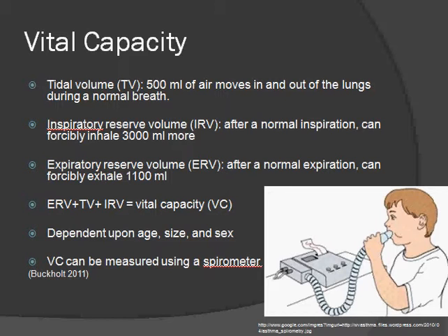Vital capacity is dependent on age, sex, and height, as the lungs of every individual are unique. Vital capacity can be measured using a device called a spirometer.